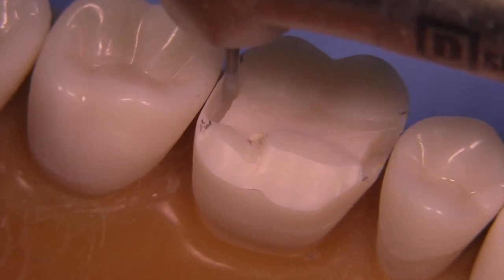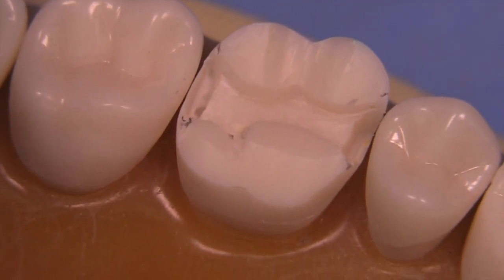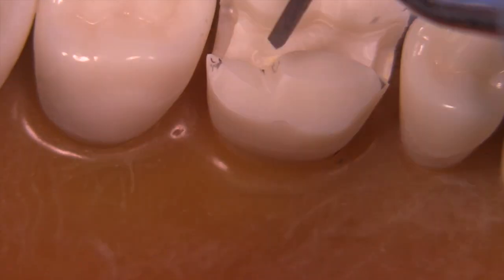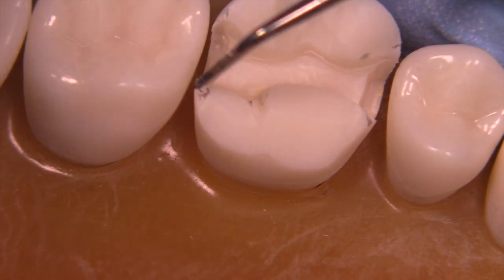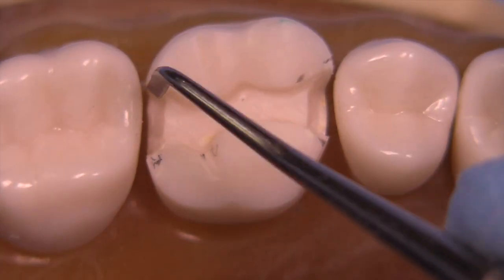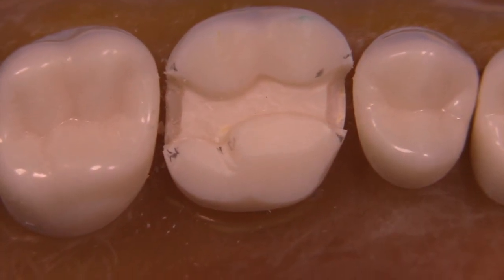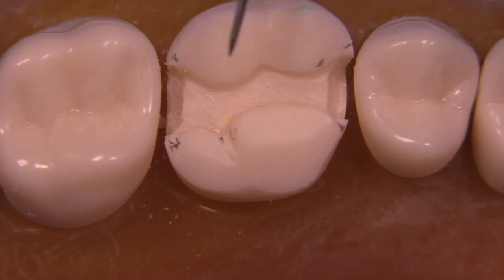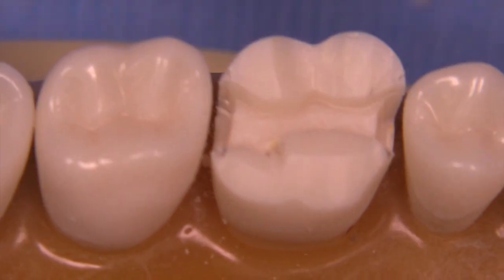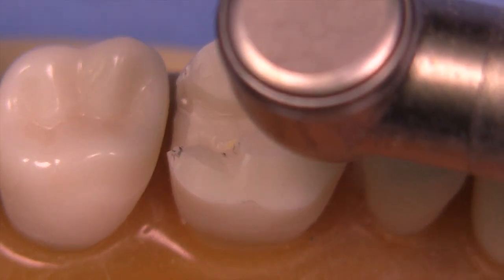Remember, the extensions on a MOD gold onlay are greater than for amalgam — at least 0.5 up to about 1 millimeter depending on location. Sharp instruments like an enamel hatchet, off-angle chisel, bin-angle chisel, or any sharp flat-ended chisel are really helpful to get the initial form of the box defined. Notice that we're breaking contact in all areas, though it's a bit conservative in some spots — we can drop the box a little further gingivally if needed to gain enough clearance for the gold restoration.